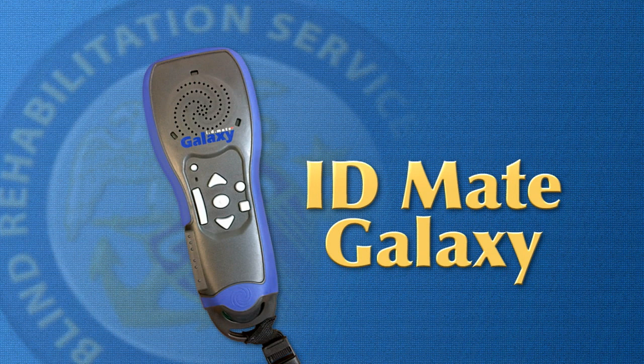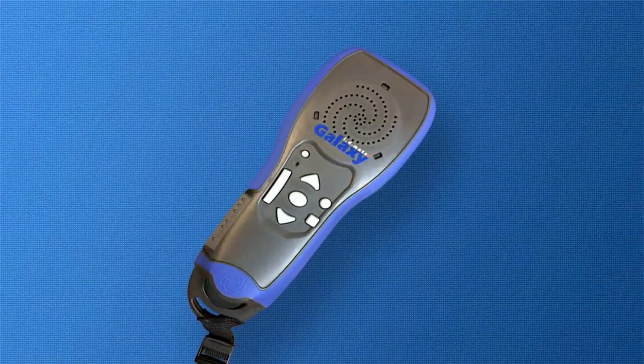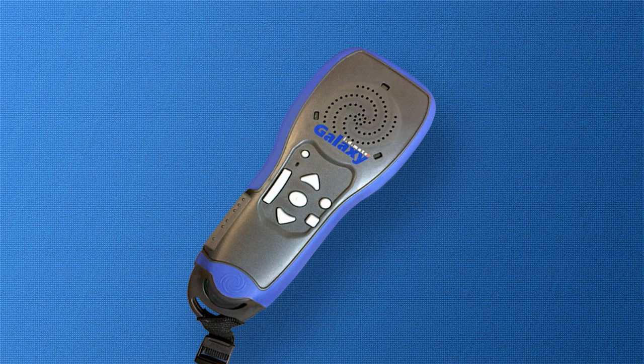Let's begin with a brief orientation of the ID Mate Galaxy. To ensure proper positioning of the device in front of you, place the button side up with the lanyard closest to you.